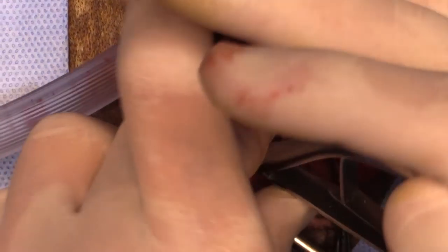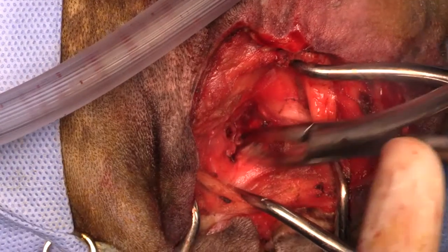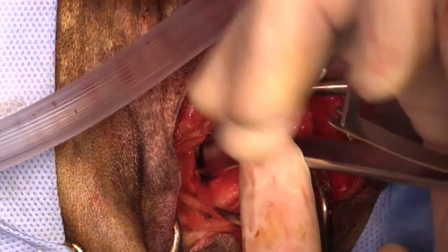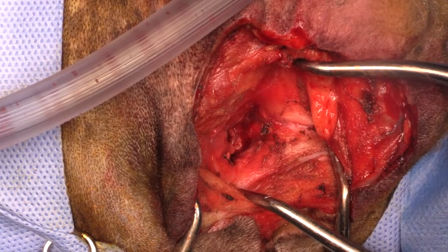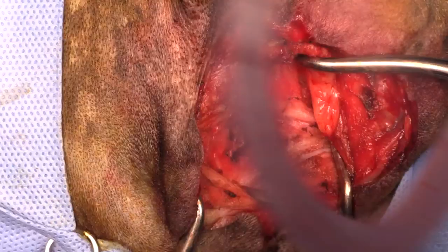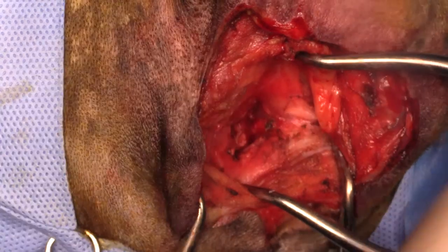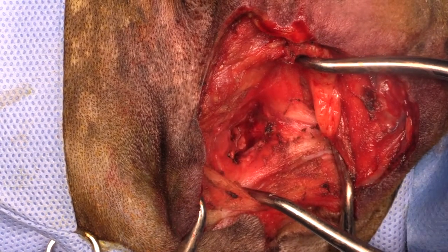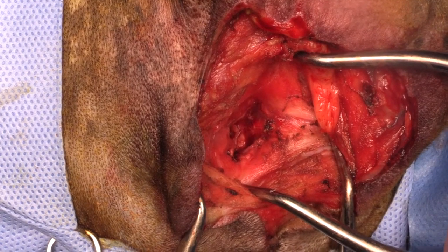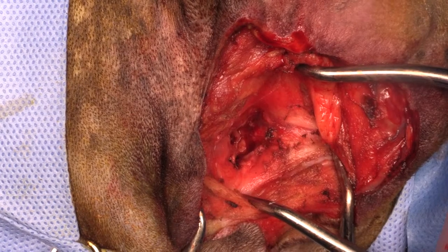So I would base it on culture, and I will be honest with you, I don't manage these medically. They're always managed by somebody else, and then I just come in and do the salvage procedure. I know that a lot of these would be on enrofloxacin, and that exudate has blocked the suction tip. So that's nice that we've gotten some out of there. Just unclogging the suction tip now.